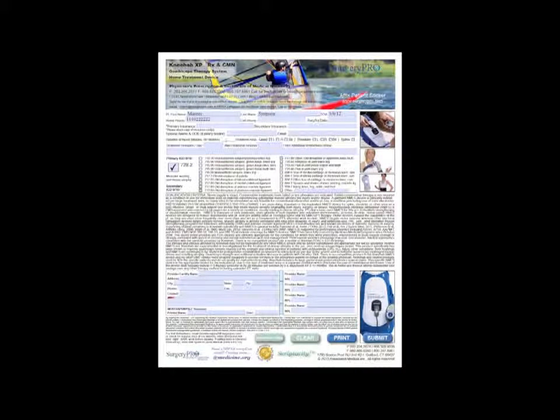Duration of need, typical duration of need on this would be 3 to 6 months. Prescribe it longer if you want to be on the safe side. Otherwise, we're going to have to come back to you for extensions. 99 is lifetime.